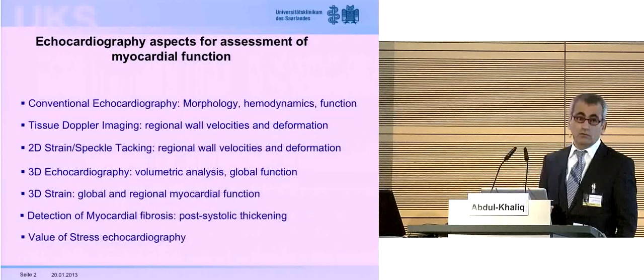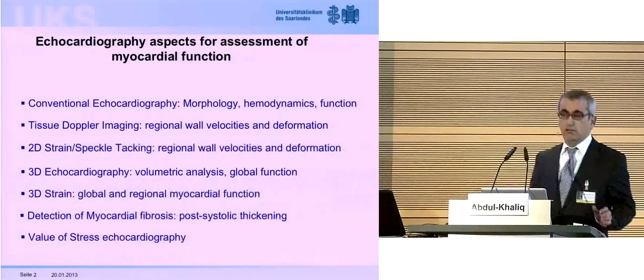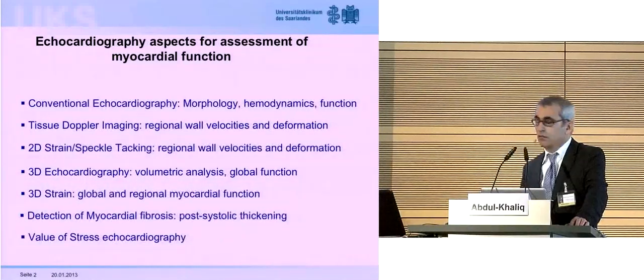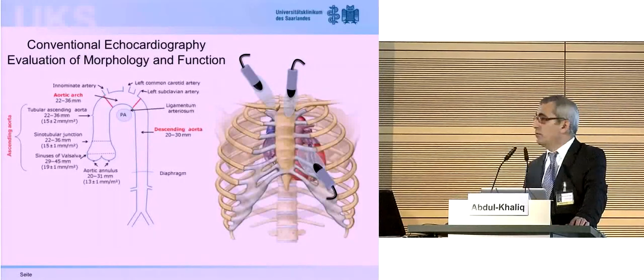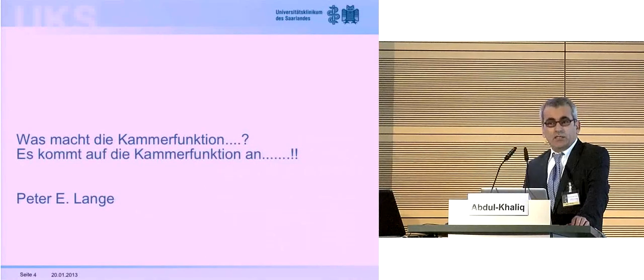And which value have these methods in detection of not only global myocardial function, but of latent myocardial function, and the value of stress echocardiography. So you know all of these tools to evaluate the morphology and function of the aortic valve and the left ventricular outflow obstruction. And it depends on the function.